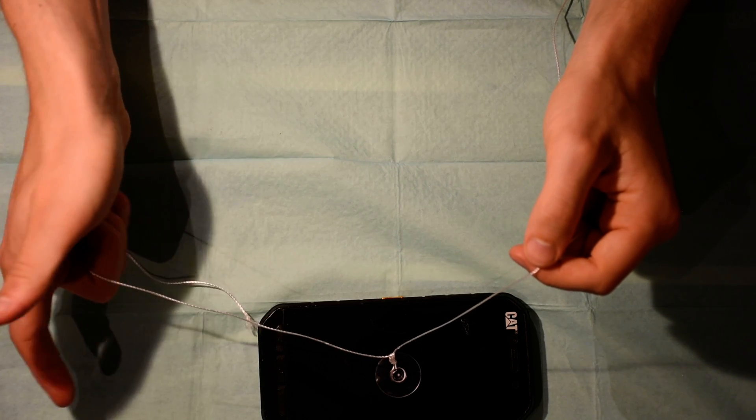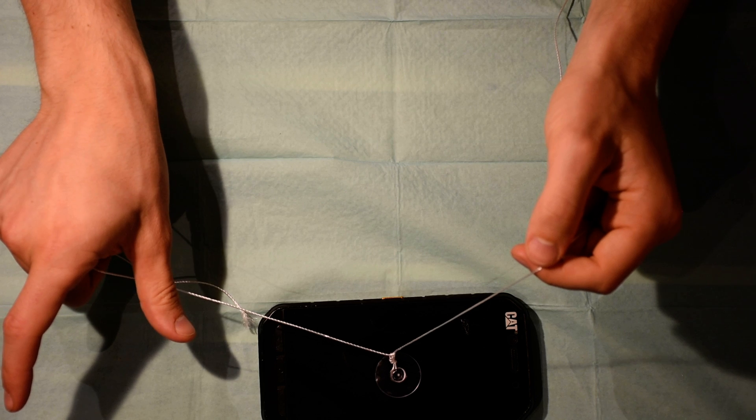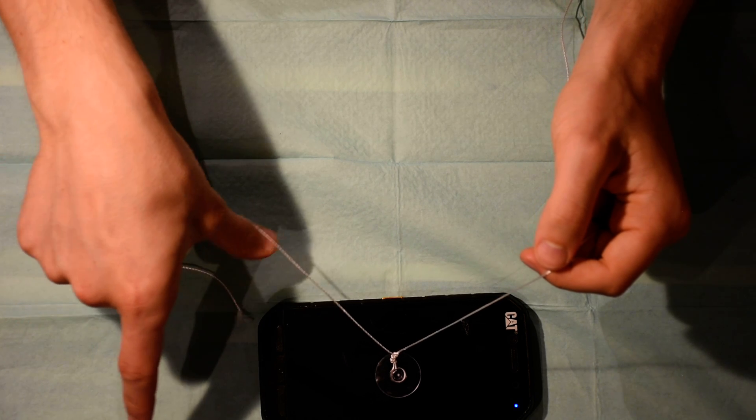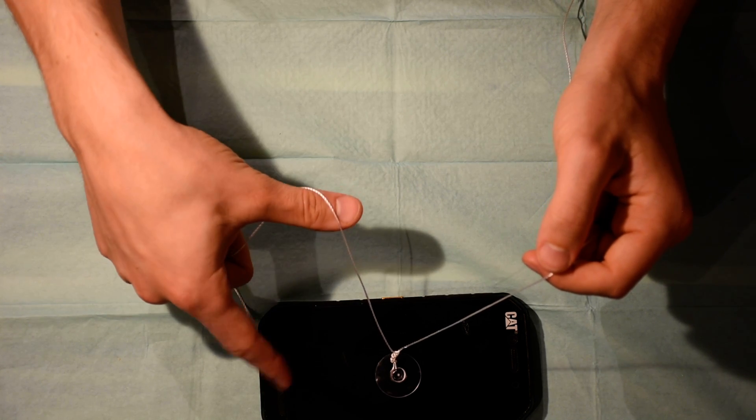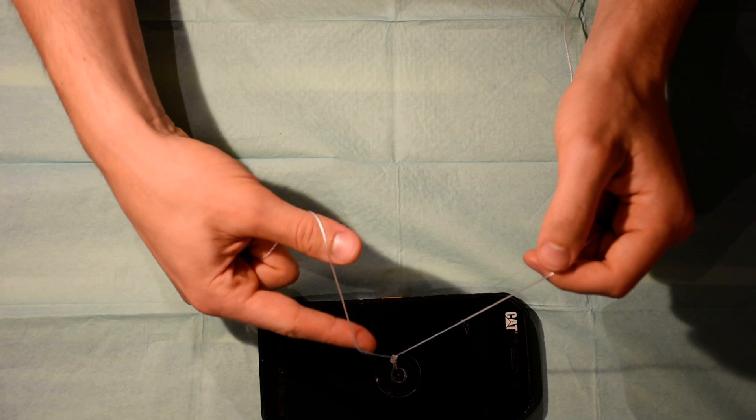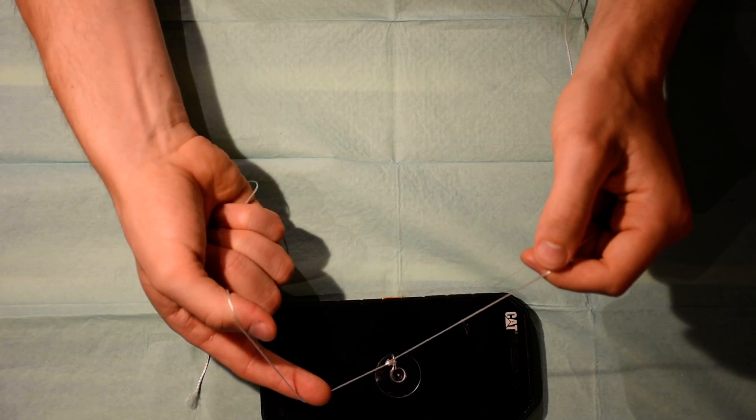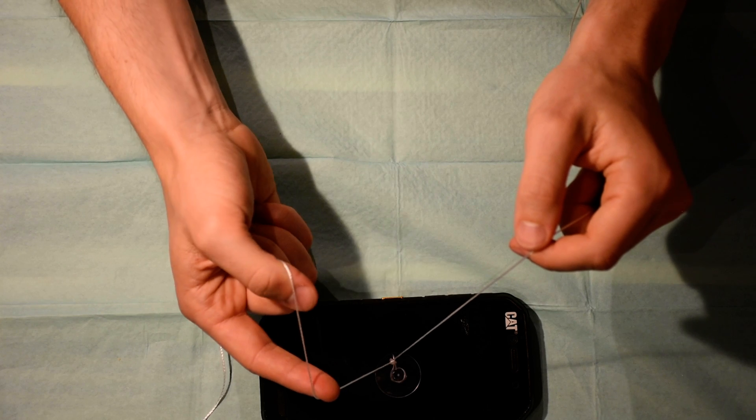You start with putting your thumb on the cord then behind the cord like this. Then you take your index finger behind the cord as well. Then you have the cord presented between your index finger and your thumb.